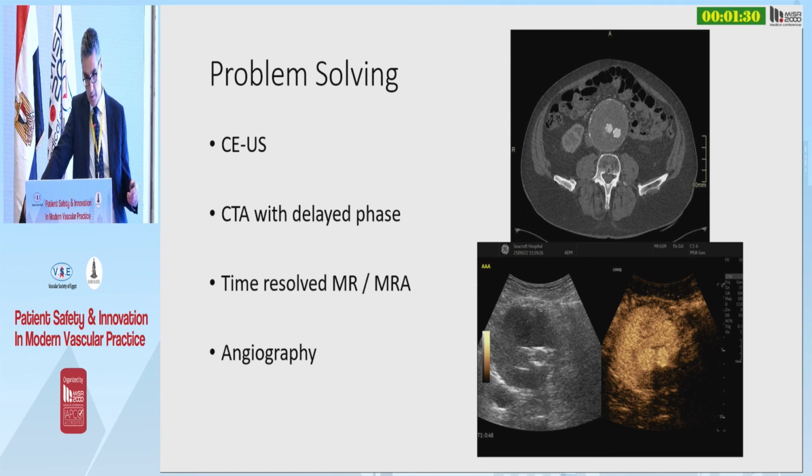And you can see on this image, this gentleman had his EVAR in 2017. It was done at 6 centimeters. It's now approaching 9 centimeters. Nothing seen on CT, even with delayed imaging. But actually, he's got a massive IMA type 2 endoleak. This was only done last week.